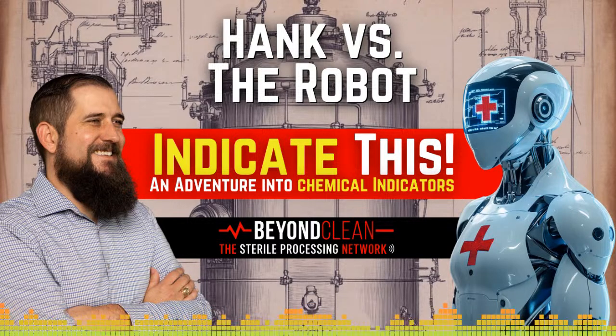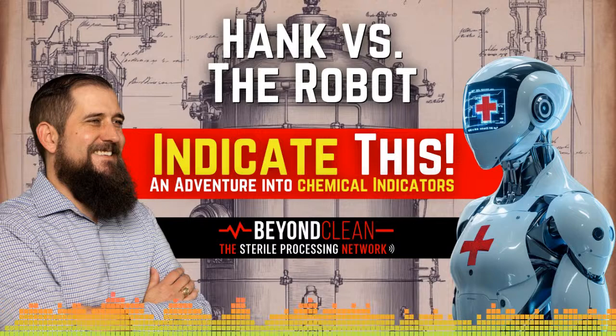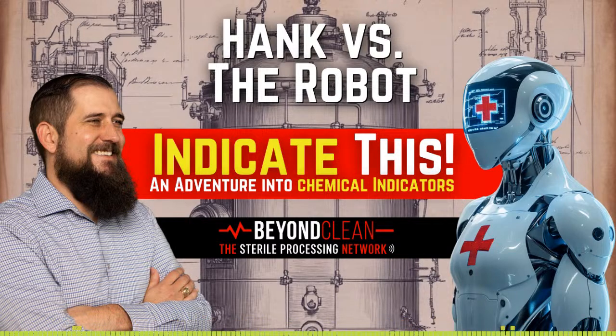They're like receipts for the sterilization process. They confirm, yes, we did it right, and here's the evidence. Without them, you're asking for blind faith in machines and processes. And as you know, in SPD, blind faith isn't a strategy, it's a liability. Even with the most advanced technology, those little strips of paper or moving ink lines are still one of the best ways to ensure patient safety and peace of mind for everyone in the chain of care. So could we do it? Maybe. Should we? I wouldn't bet a patient's life on it.